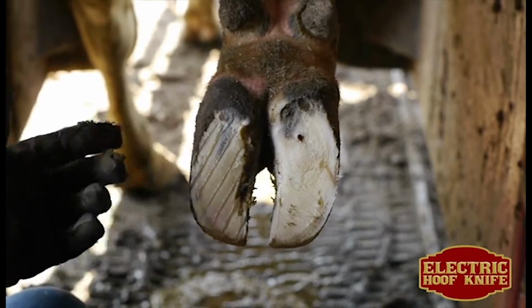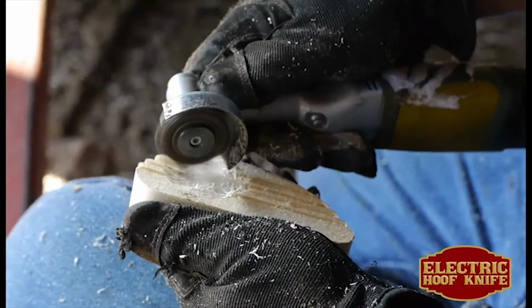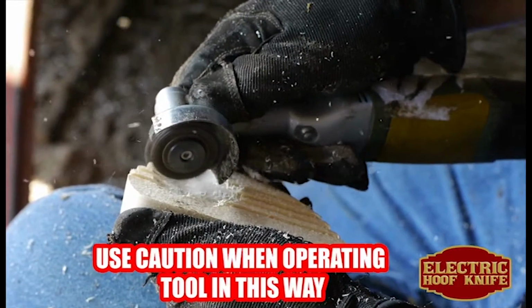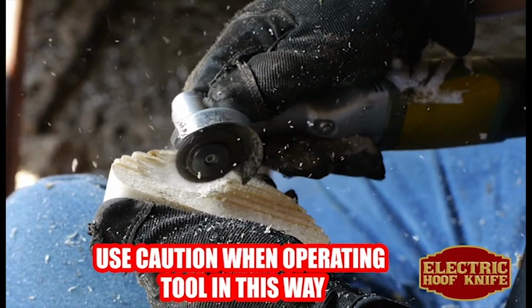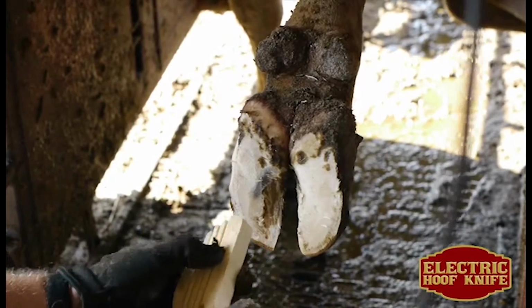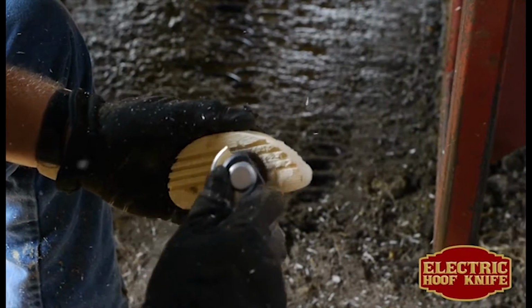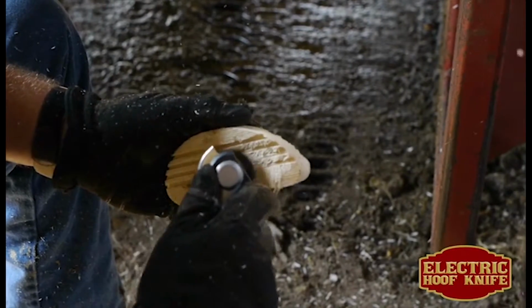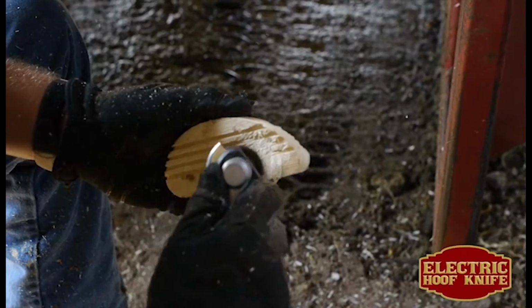If you must apply a block to the claw that has had the corrective procedure performed on it, you can use the electric hoof knife to gently scoop out part of the block for a better fit and to promote faster healing. Holding the block up to the claw, mark the block where you need to make the cut. Then, holding the block flat in your hand, gently pull the electric hoof knife along the wood to carve out a space that matches the size of the injury.